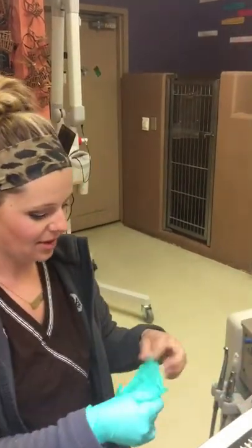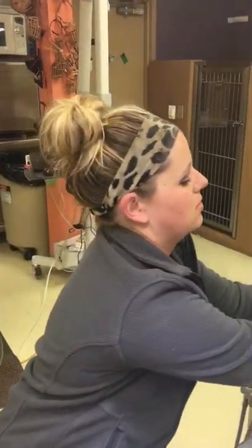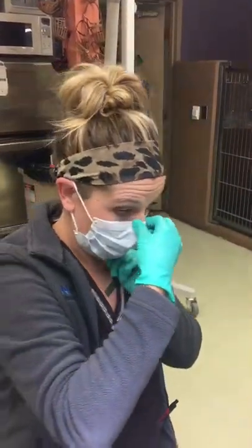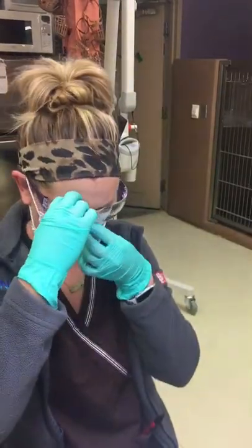Start by putting on your PPE, or your personal protective equipment. It is recommended to wear gloves, a mask, and protective glasses. These will help protect you from harmful bacteria and possible contaminants that aerosolize during the procedure.